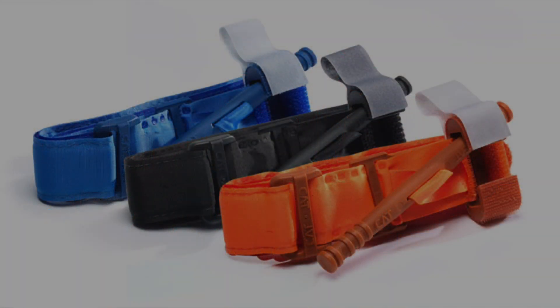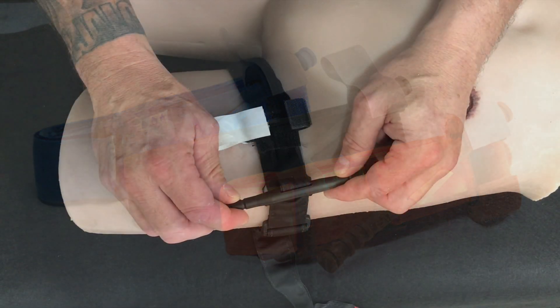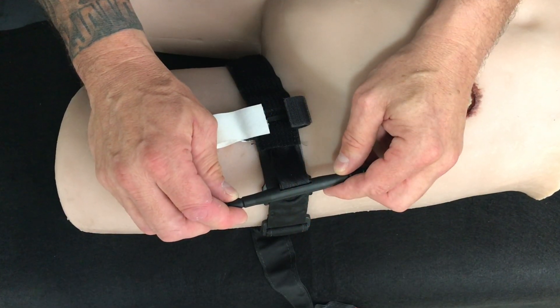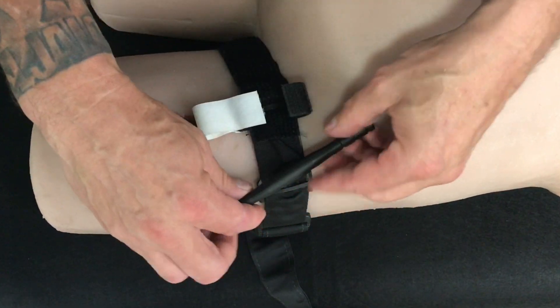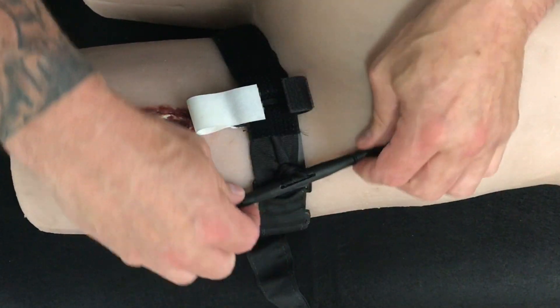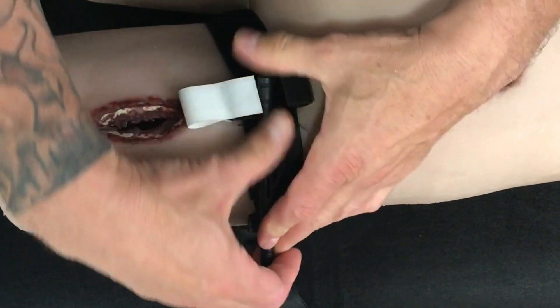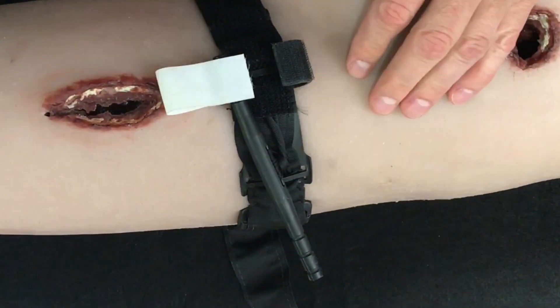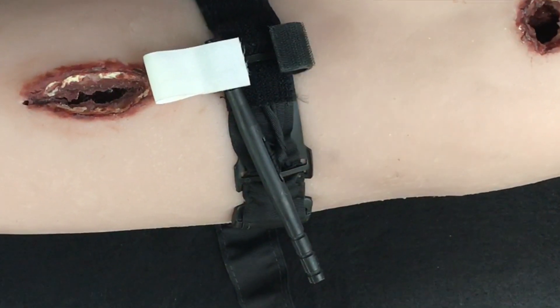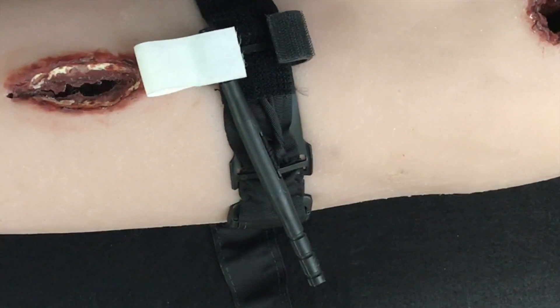You must buy an additional training tourniquet to establish muscle memory and become proficient. This is due to the windlass tightening process, which relies on turning a rod that twists the attached nylon in a circle to tighten. The rod is then placed in a clip to hold it in place. Nylon webbing was never designed to be twisted in this manner — it causes the nylon fibers to shear and weaken with only one use.